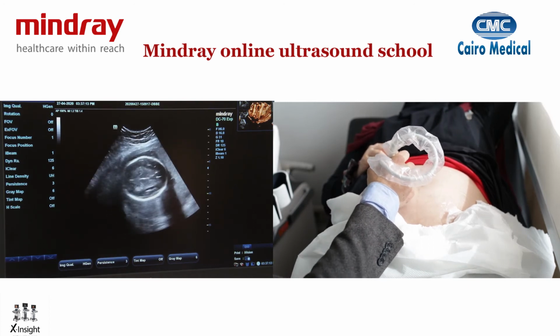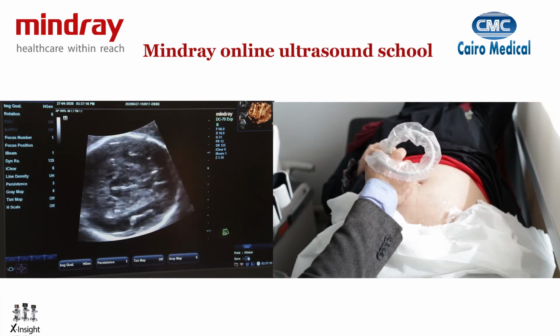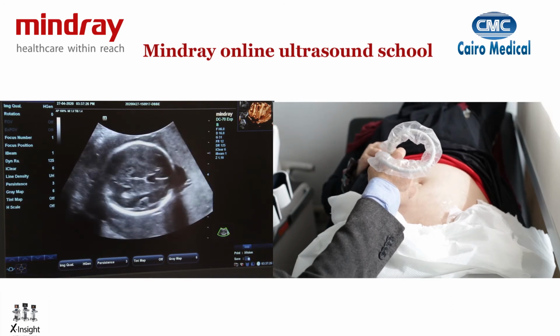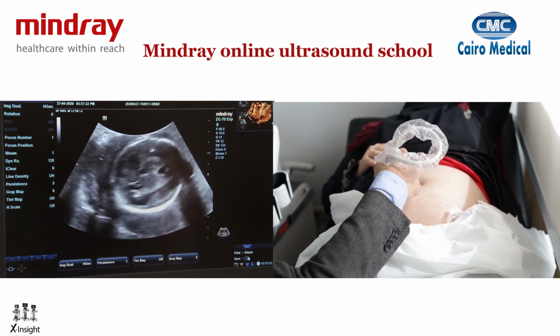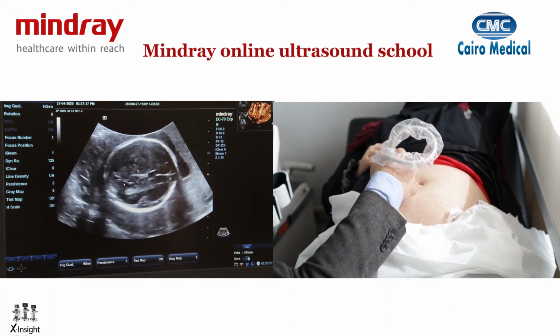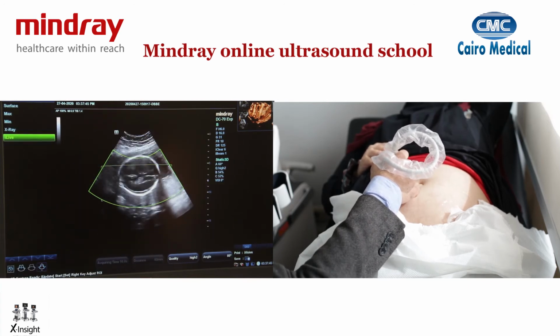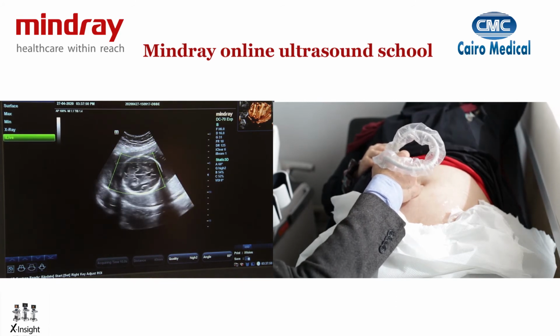We can now move into multi-planar imaging, where you can get a view of any structure and move around it, so you can get a better and closer utilization of the 3D images you have. For instance, here I have the brain, and I have all the structures of the brain. I can see the lateral ventricles, I can see the cerebellum, but I cannot see the midline structures well, and that's one of the big utilities that you can use with 3D. So what we're going to do now is use static 3D and not just real-time 3D or 4D. We're going to be using static 3D and taking a volume of this fetal brain.